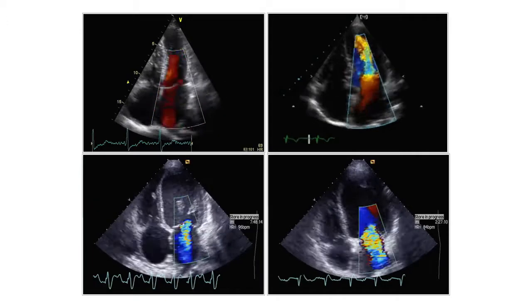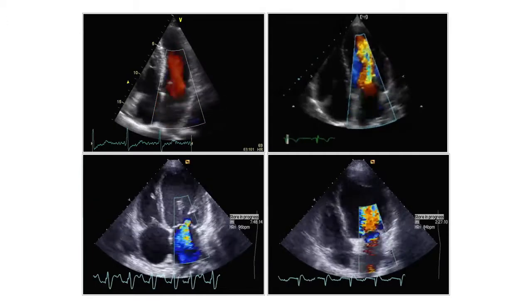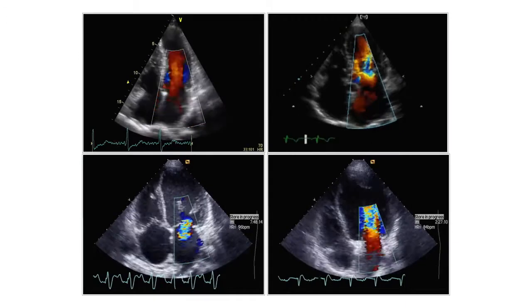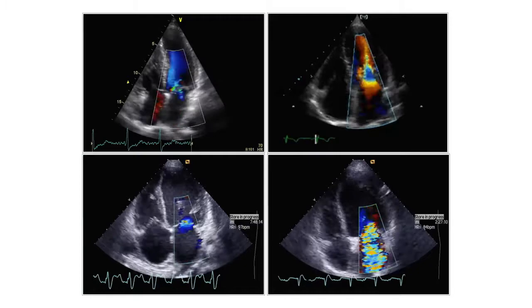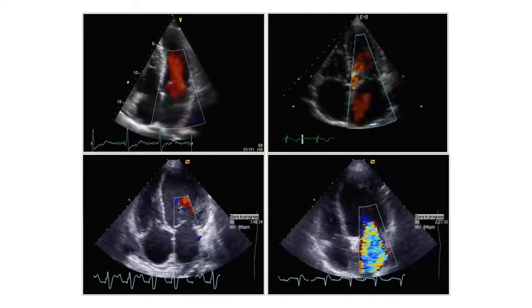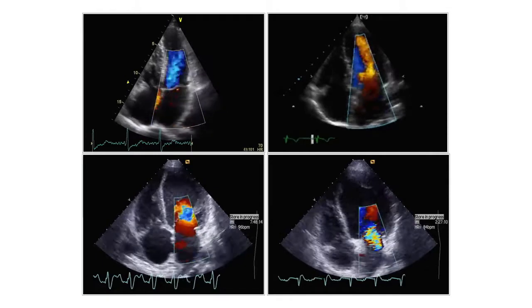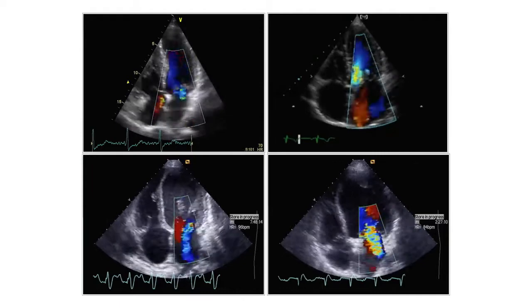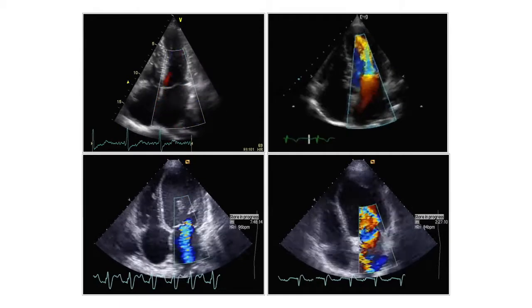we do not have such a big regurgitant jet. We only have a small jet, only barely visible, blue, actually. Exactly. No mixing colors, no turbulent flow. Yeah. So this is almost very difficult to pick up. You'll see this in normals as well. It's a very common finding to have a little bit of mitral regurgitation.